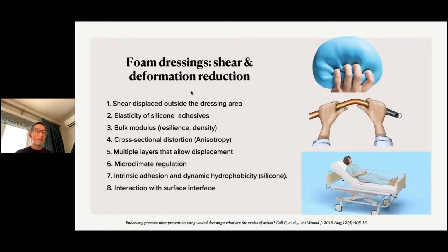So first of all, with a multi-layer foam dressing, it depends on the size of the material. It can displace the shear outside of the dressing area. So in other words, when you're thinking about using foam dressing prophylactically, think of a larger size of foam dressing. I know as clinicians within the healthcare system, we're very cost conscious, we're trying to be very frugal. We want to use the smallest dressing possible. Sometimes we might want to even cut the foam dressing. But this is not really the time to be cost saving here, because if you use a small dressing, the displacement of pressure and shear is only very minimal versus a larger size of dressing that you can optimally displace the pressure and shear problem.